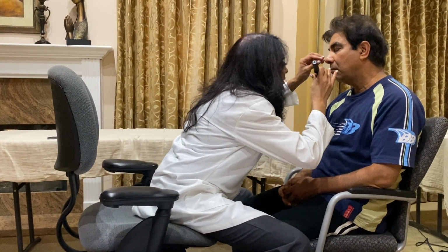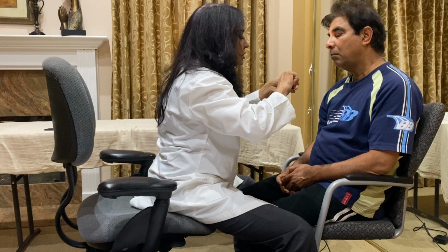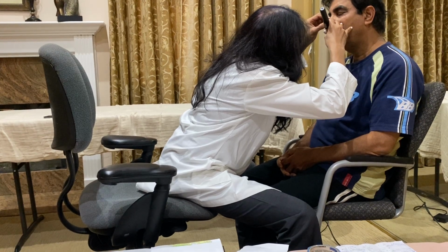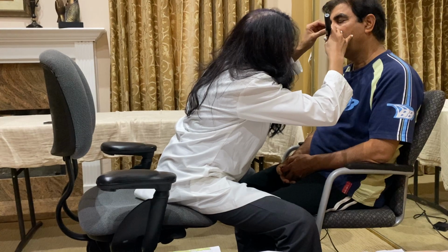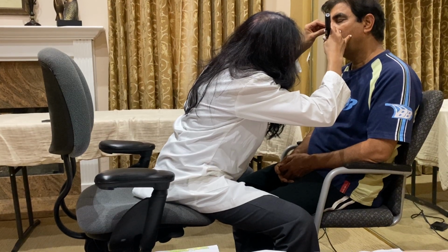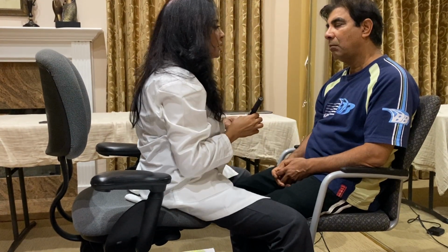So I'm going to get into your nose. I'm going to set my otoscope next to the ala, and I see that his nasal canal is even. The septum is not deviated. There's no wounds. There's no drainage. I see the turbinates are not swollen, and they are pink, and the meatus is present there. It's good. There's no drainage, no bogginess in the nose.